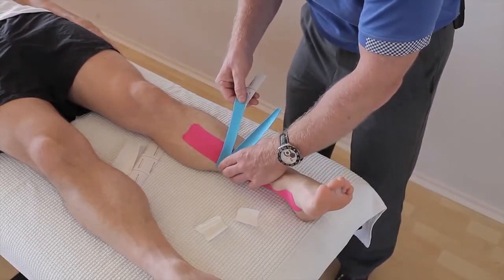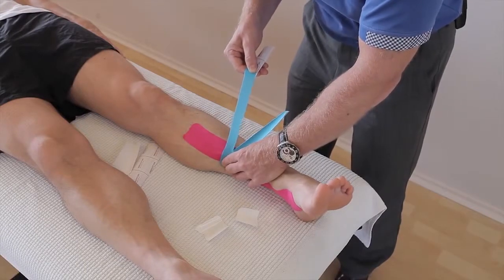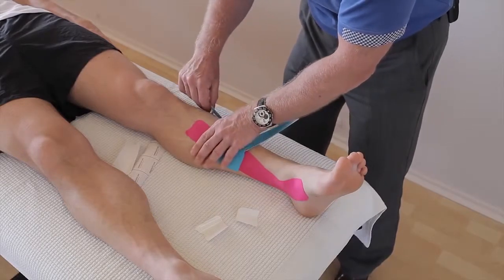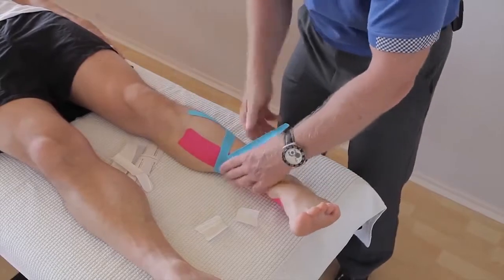So what we can do now, we can use your fingertips to pull in the muscle a bit, 75% stretch, so 100 back off to 75. And as it comes up on the lateral side, you can just ease it off and mold it around. So that's the first one. And then the same on this one.